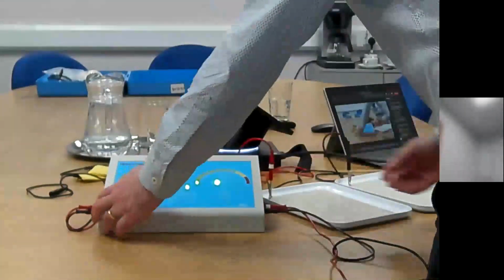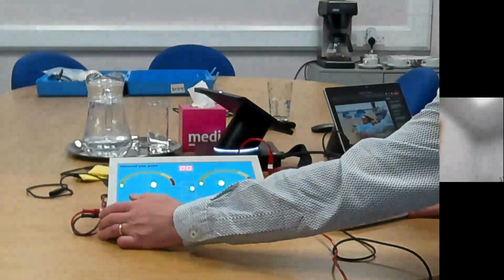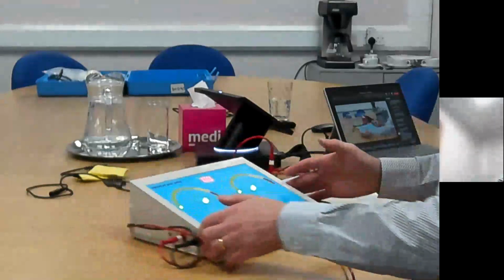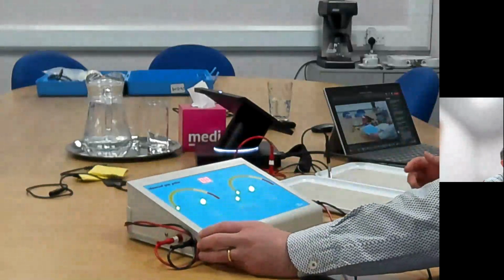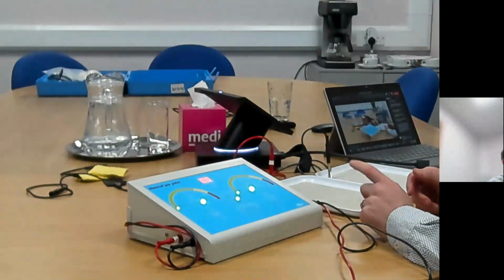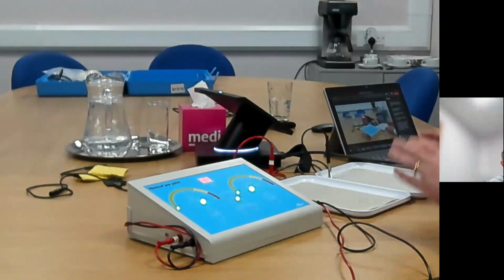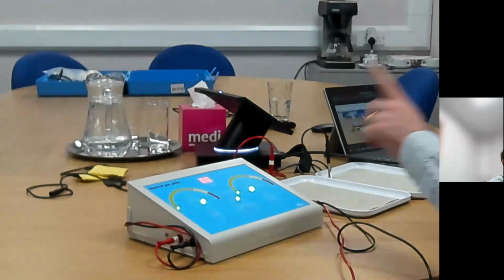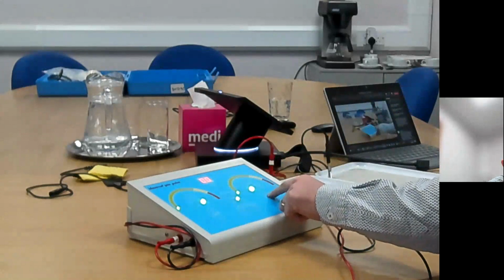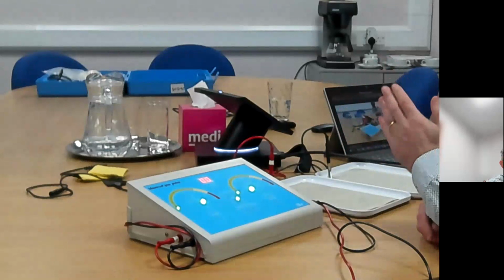Now, the feet need to have more current than the hands. The best way that we found for this to be done, and I've tried this with a number of departments and quite a number of nurses, is to start the feet off first. So the feet are going to need to have 30 minutes in total, hands 20 minutes in total. So if you start the feet off using the generator on the right hand side, you increase the current until the patients can feel a tingling in their feet, time for 5 minutes.